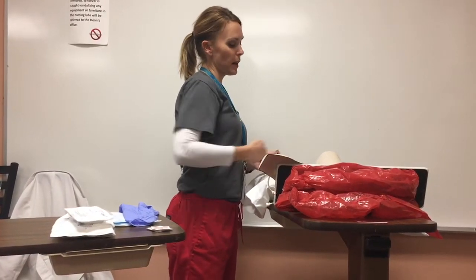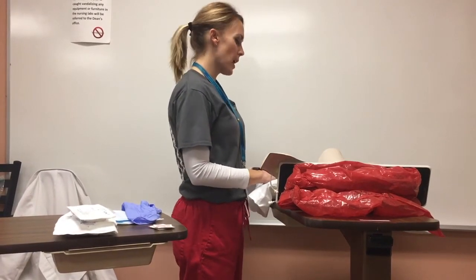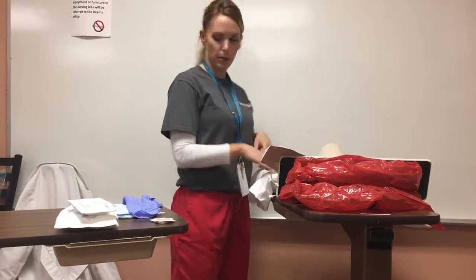When I get ready to pull out the catheter, I'm just going to have you hold your breath for a second, and once it's out you can breathe. Then I'm going to hold pressure for maybe five to ten minutes.